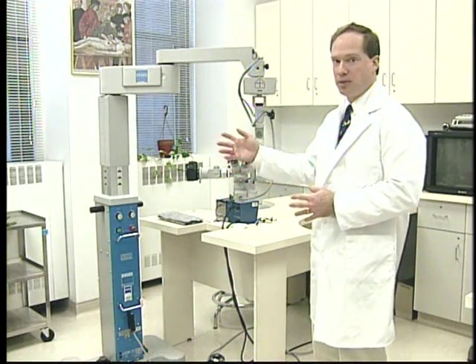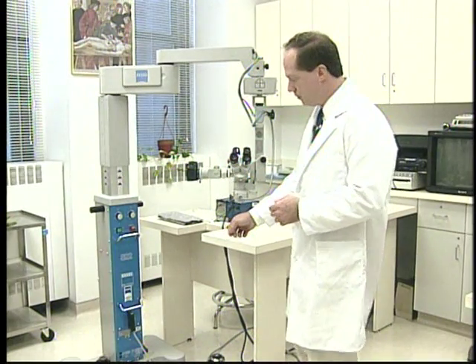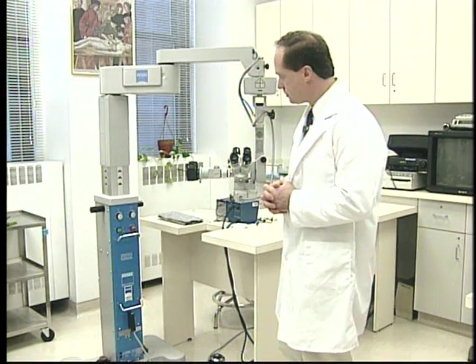Let's look at the biggest part of the microscope first, the body here. You'll notice that there are some cords coming out of the body. One of them goes to the electrical outlet, and it's essential that this be plugged in, or the microscope will not work properly. There's usually another cord that goes to the foot pedal, and there may be other cords that go to the other pieces of the microscope depending on your own particular scope.